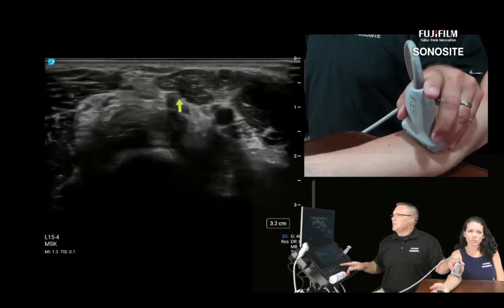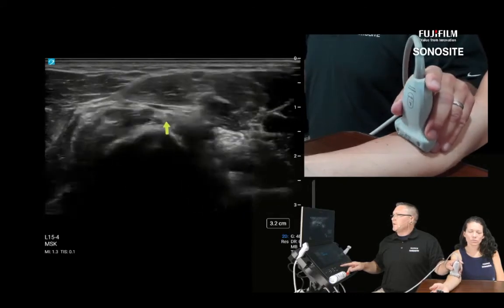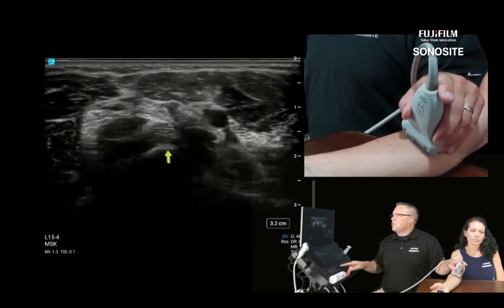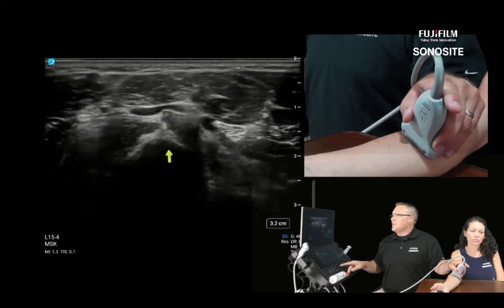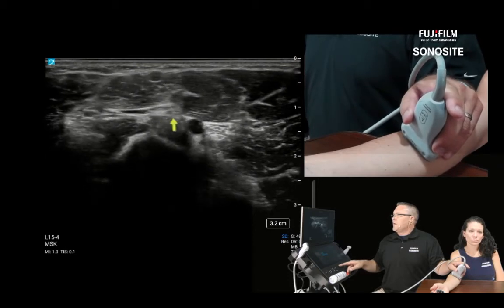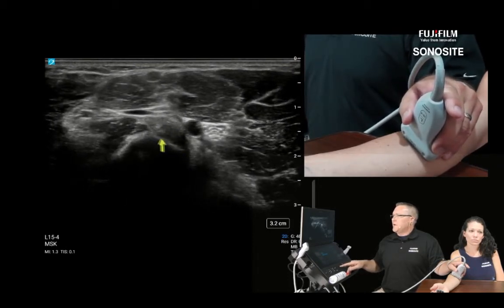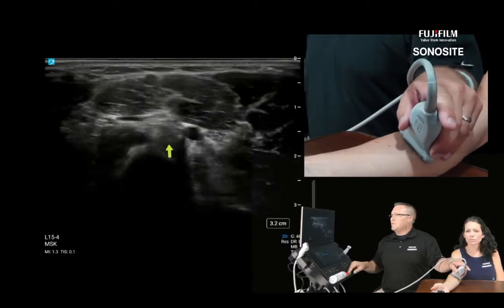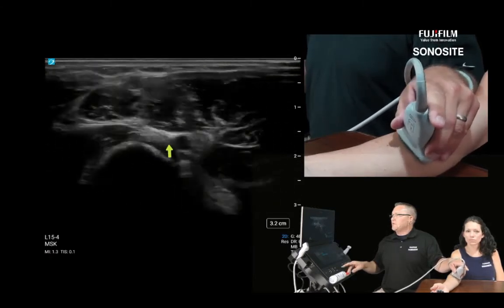And I'm going to follow the shadow again because anisotropic artifact is not always bad. Now watch that anisotropic artifact start to merge with the radial neck area, and then after the radial neck, as we saw on the long axis, we'll see the radial tuberosity. So here that anisotropic artifact is starting to splay out and follow the radial tuberosity insertion right here. I'm going to check my angle and angle the handle distally. There we go. And look for maximum reflection.